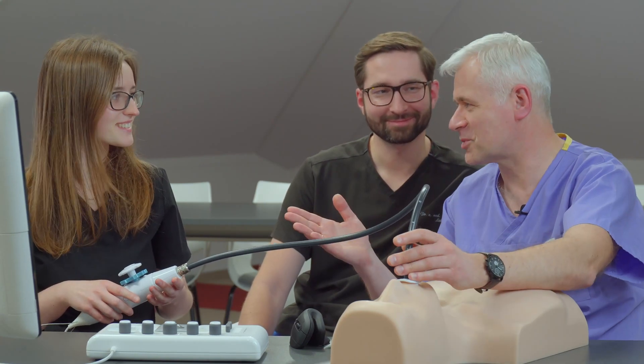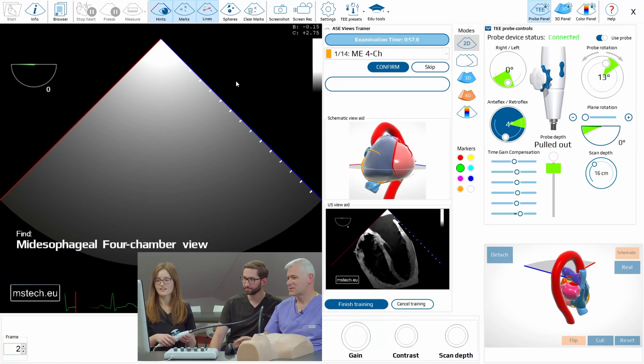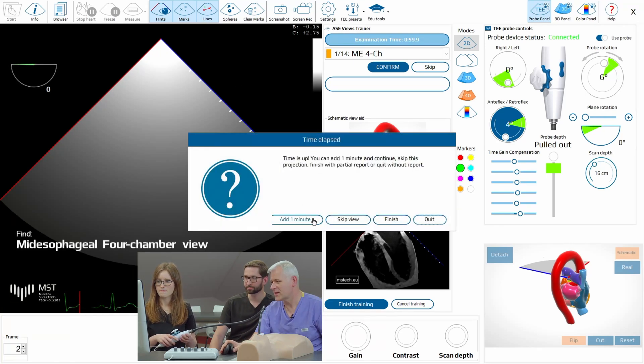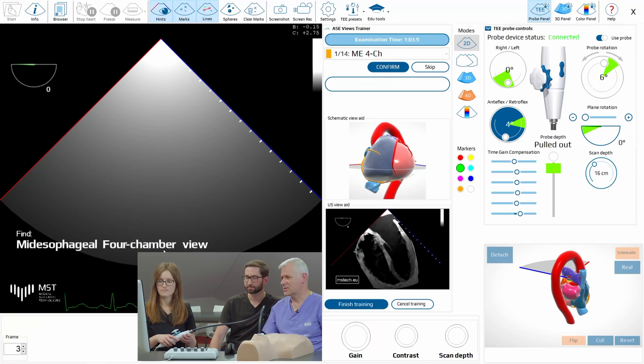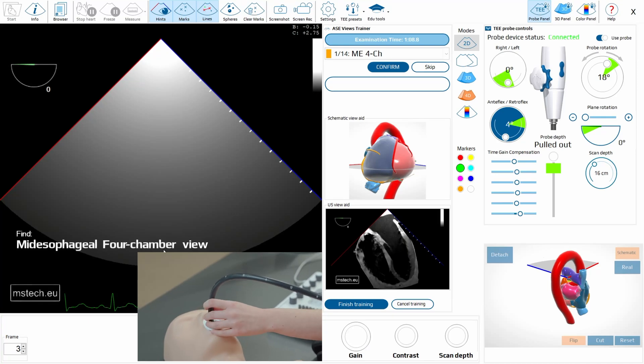Okay, you are just watching what we are doing here. So now let's try. You have a chance to follow the steps that Alec has just shown us and let's try. So here you see that you know the rules. You have to show the four-chamber view and try to do it. So maybe you should go a bit deeper.